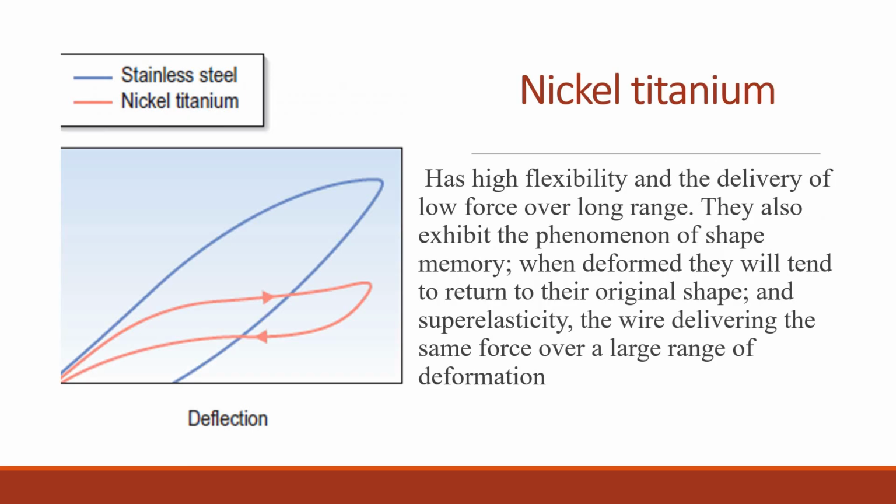Nickel titanium, or NiTi, arch wires are characterized by high flexibility and the delivery of low force over long range. They also exhibit the phenomenon of shape memory: when deformed, they will tend to return to their original shape, and superelasticity, the wire delivering the same force over a large range of deformation.